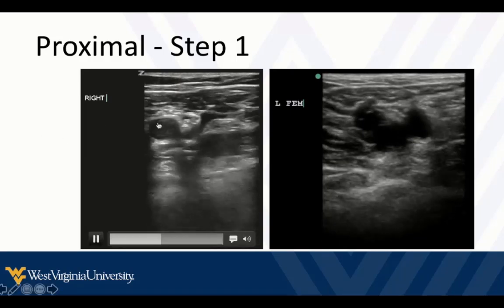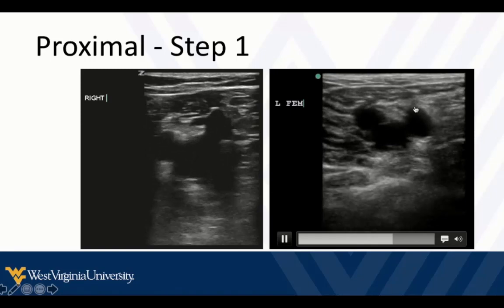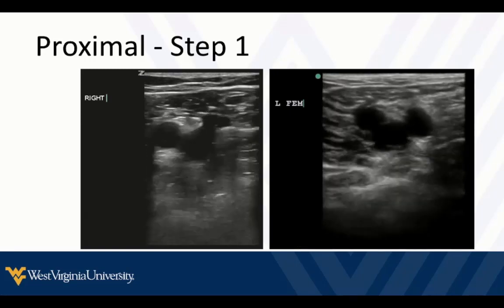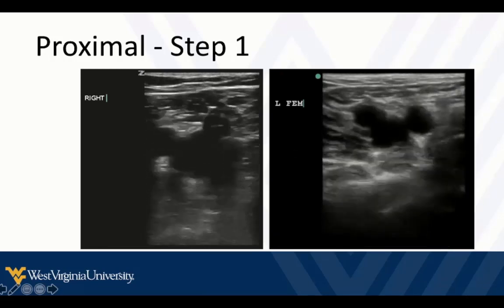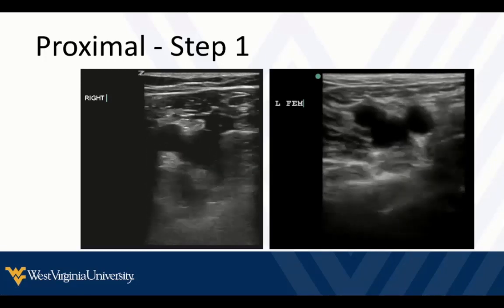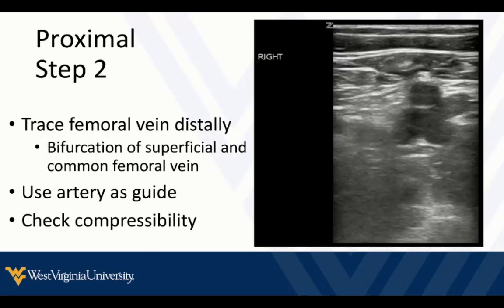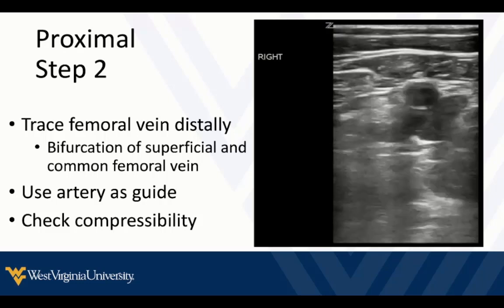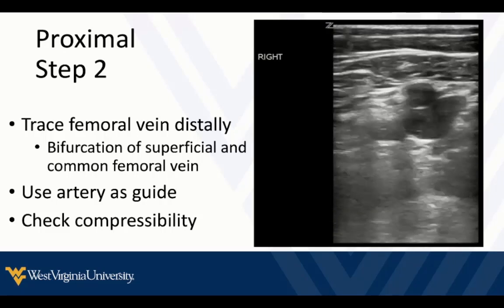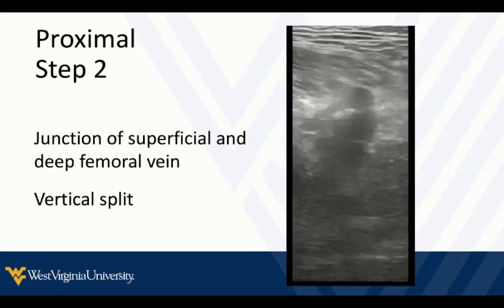On the right side, remember the artery is always going to be the most lateral structure. The indicator is directed to the patient's right no matter which side we're doing. On the patient's left side, here's the artery more lateral, and we see the saphenous and femoral veins medially — they compress completely. Now once we see those, we generally just follow the femoral artery and vein. Every centimeter or two, we continuously compress the vein and make sure it compresses everywhere. Use the artery as a guide and check compressibility. We'll see the veins splitting into two, usually only a centimeter or two — maybe three — distal to the sapheno-femoral junction, so this is all still pretty proximal in the patient's thigh.